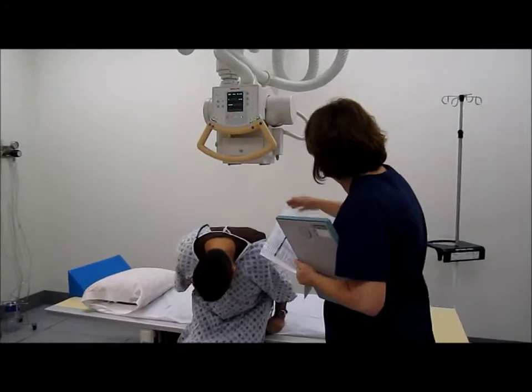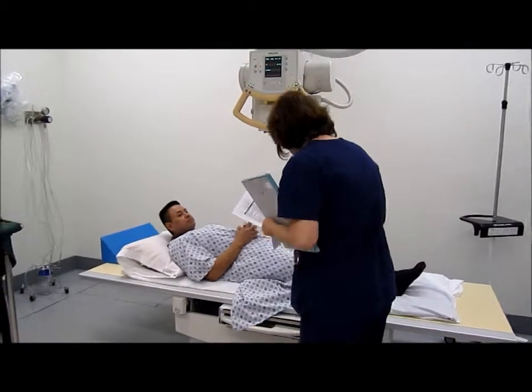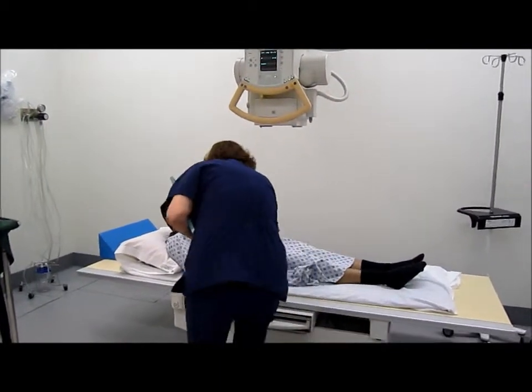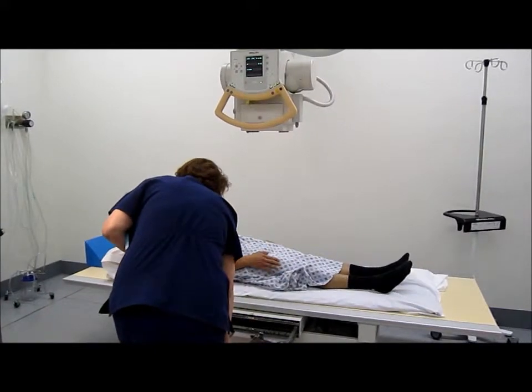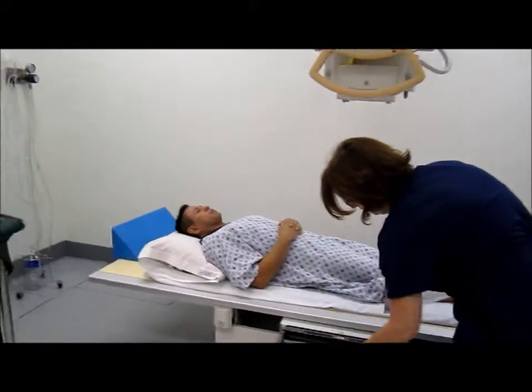And we'll start with your AP. You can go ahead and turn around and lie back if you like. And it is your right knee. All right. So I'll go ahead and place the cassette in the bucky.